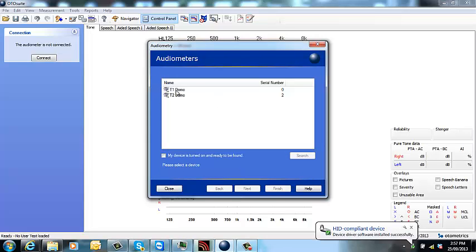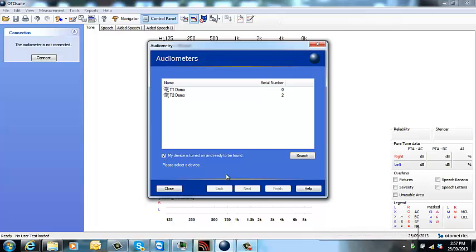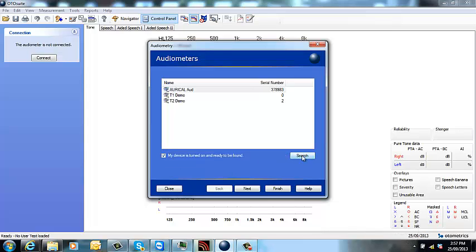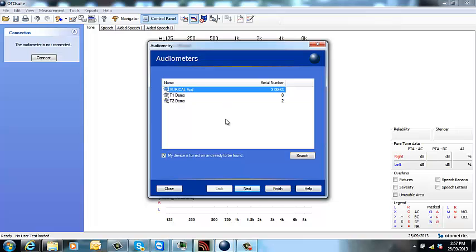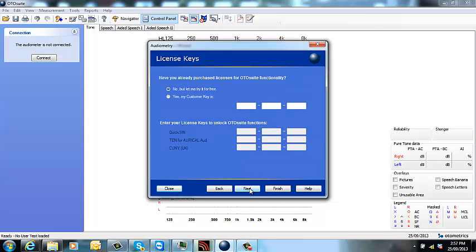Now you may have these T1, T2 demos available. Don't worry about those, just click my device is turned on and ready to be found and then click search. Now just make sure that when it pops up the serial number is correct. Highlight that one and then just click next.